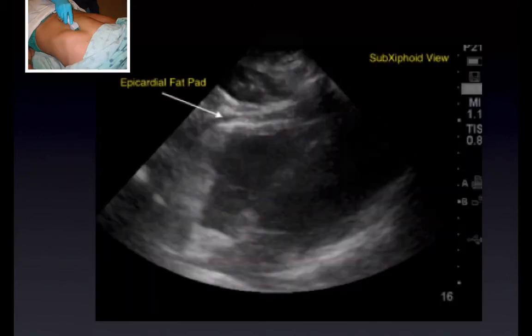And one common pitfall is that some people see this area surrounding the heart on the superior portion, and they get confused about whether it is a pericardial effusion or not. Remember, fluid is completely anechoic and dependent. Some folks, and we probably all do to a degree, have an epicardial, pericardial fat pad. So you see that area that looks like there's fluid, but if you look closely, you'll see that there are internal echoes, a little bit of haziness there. They're called internal echoes. So it's most likely to be the pericardial fat pad and not actually free fluid.